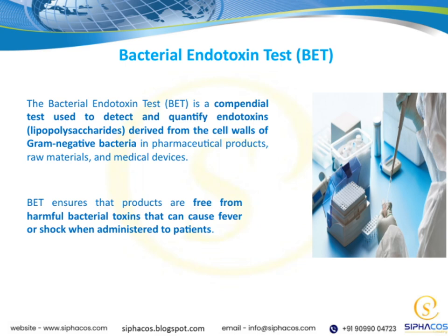Why is this important? Because if these endotoxins are present in pharmaceuticals, raw materials, or medical devices, they can cause serious reactions like fever or shock when administered to patients. So, BET helps us identify and quantify these endotoxins, ensuring that what we deliver is safe and meets regulatory standards. It's an essential part of our quality control process, directly connecting to our overall goal of patient safety and product integrity.